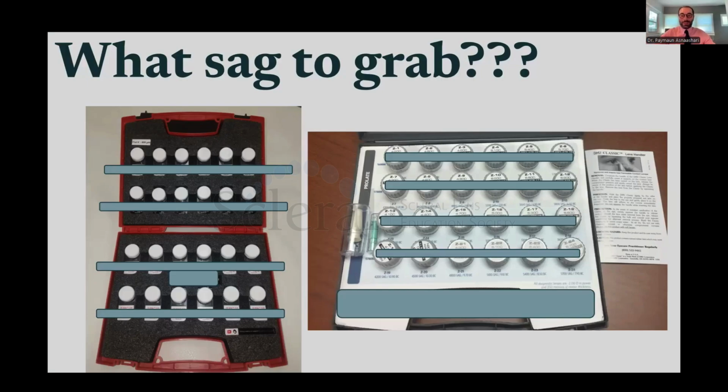How many of you have seen this? Multiple different types of fitting sets. This is what I was dealing with when I first saw this patient of mine in 2020. I got this case with no advanced imaging, no profilometry, no topography. I just had this and some fluorescein.